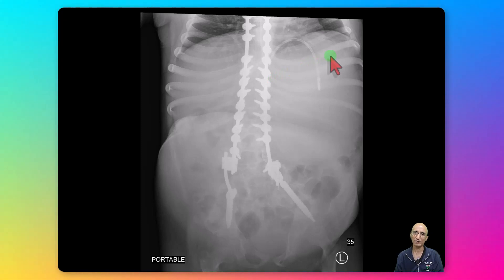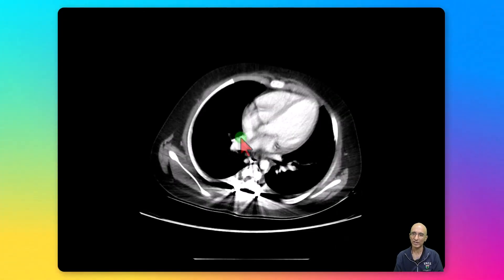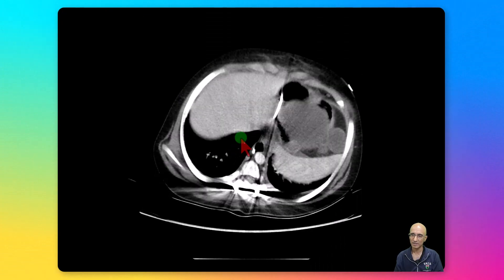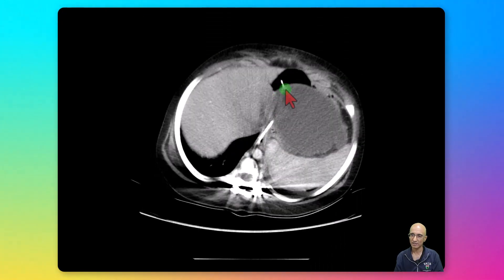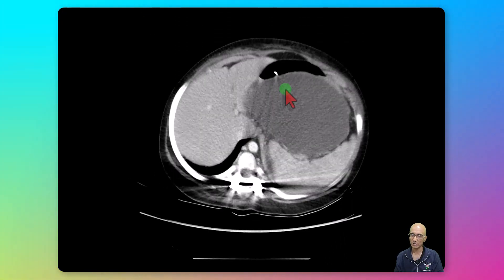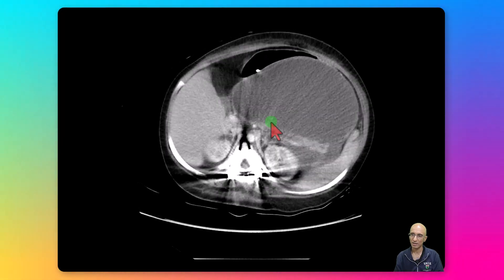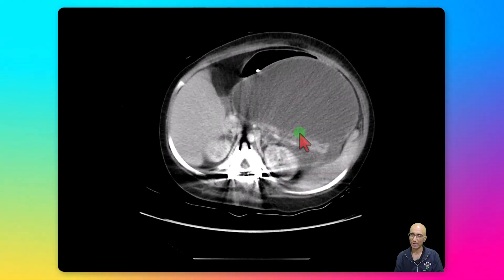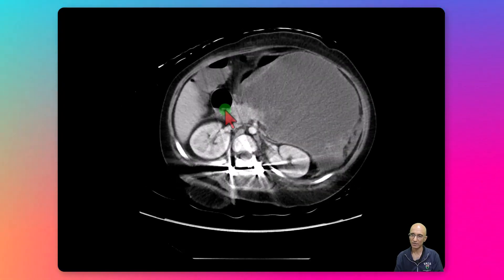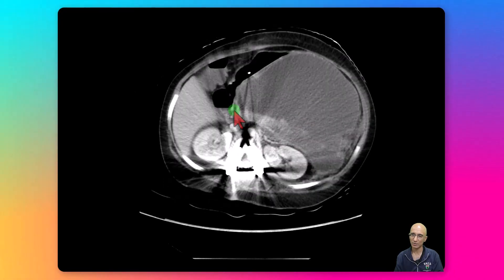The patient underwent CT scan examination for further evaluation. On the axial CT images we can see the enteric tube in the stomach, which is partially decompressed. We can see a large cystic lesion posterior to the stomach, surrounding the pancreas, which is causing mass effect on the stomach and gastric outlet.